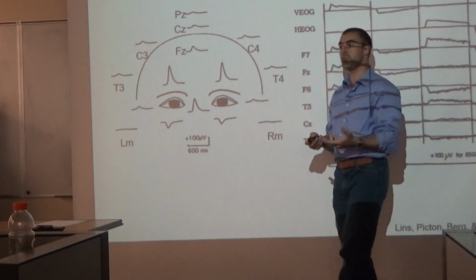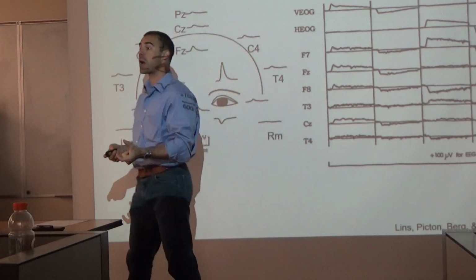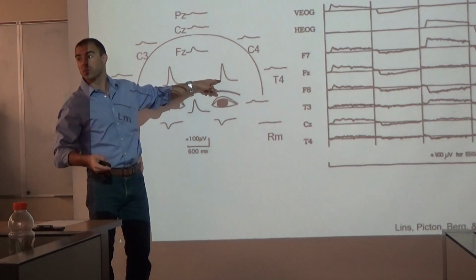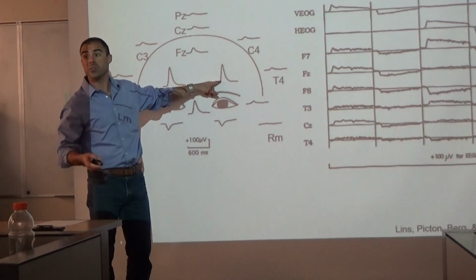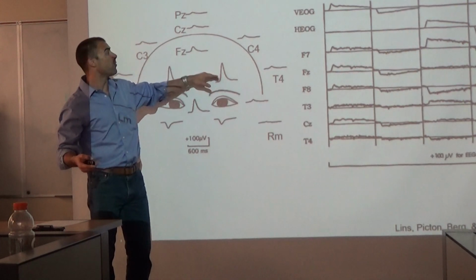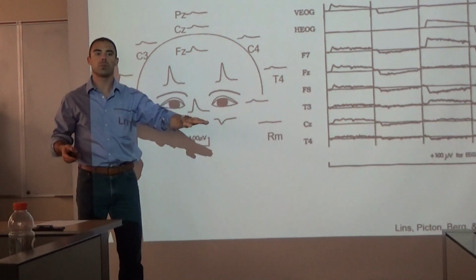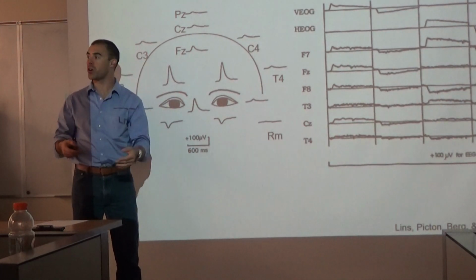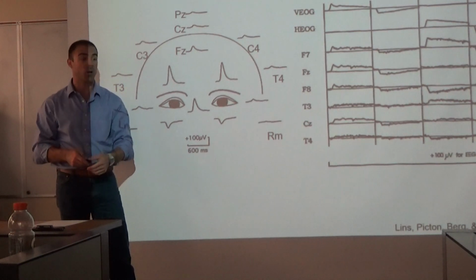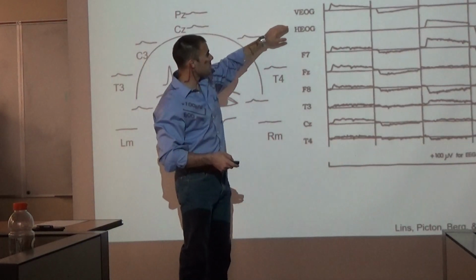One of the things that you can do is use that rate of decay to work backwards. If I know that there's an effect here that's not true brain activity, it's an artifact, you can subtract it from all the different sites at a proportional level based on that decay function. We'll talk about how we use that to correct for artifacts a little bit later in today's conversation. And we can see these other functions here too.